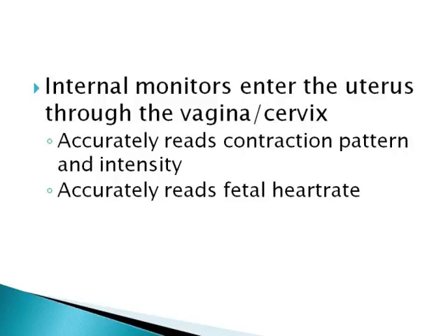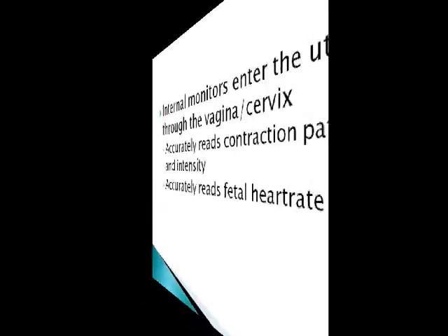Internal monitors enter the uterus through the vagina or the cervix, and they accurately read the contraction pattern and the intensity, and they accurately read the fetal heart rate.